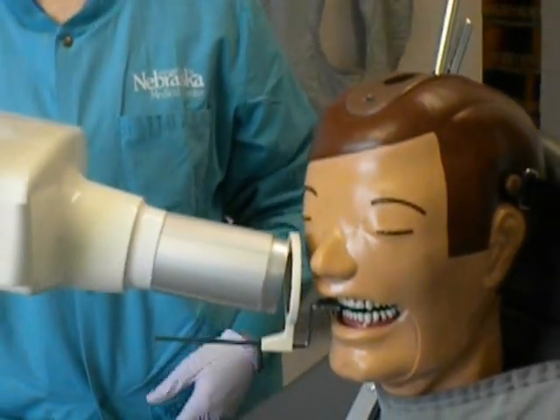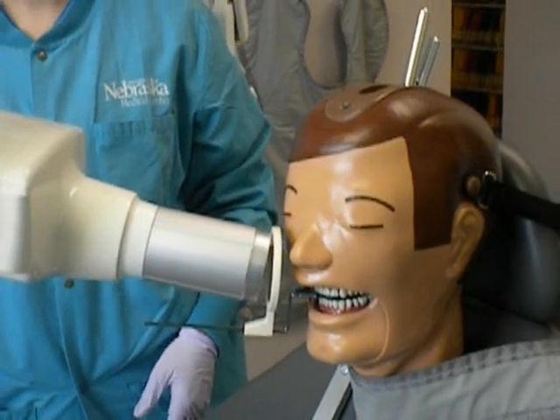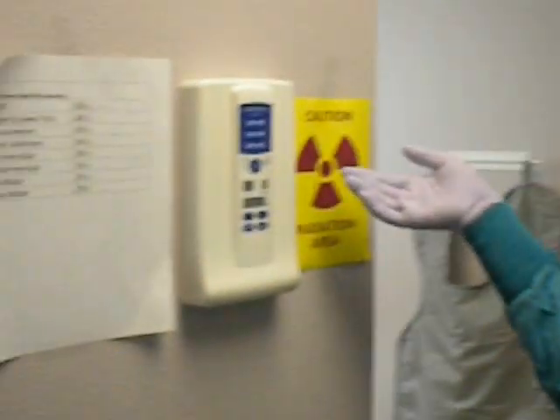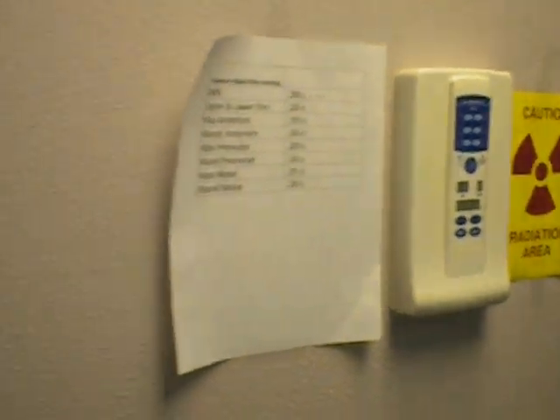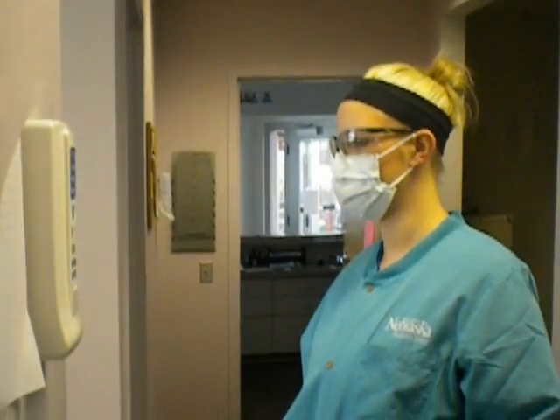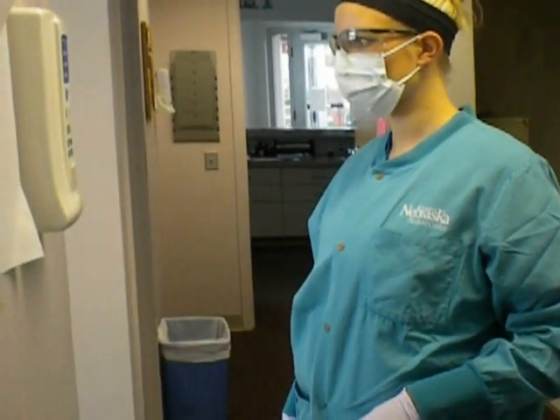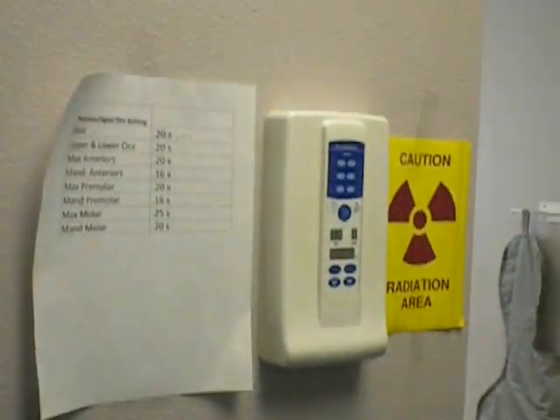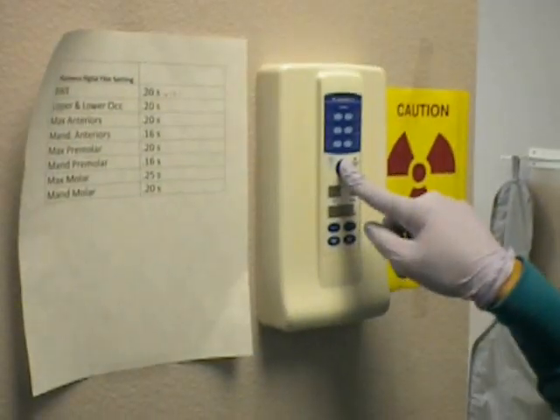Before you take the radiograph, make sure the x-ray unit is set to the proper setting. Next, step outside of the room ensuring you are at least 6 feet away from the x-ray unit. Press the button down until you hear a beep.